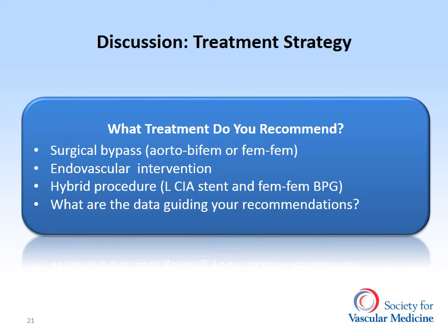Surgical options would have included an aortobifemoral bypass graft, which is a significant operation. A less morbid hybrid approach could have been chosen in a high-risk patient. This might have included stenting of the left common iliac artery and a fem-fem bypass from the left to right common femoral arteries. The durability of this type of surgical revascularization, however, is lower. In this particular case, because of the patient's preference and operator's experience, an endovascular approach was chosen.